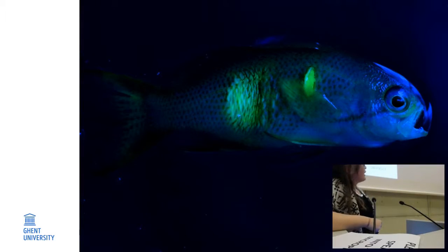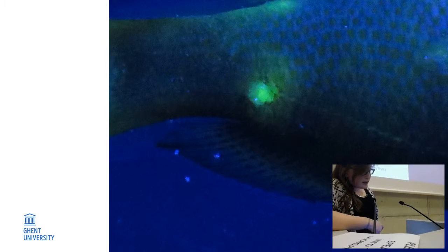If you do so, you can get this result. So here you see a fish with a more superficial lesion, and on the right side a deeper cut into the dermal and muscular tissue. Even smaller lesions, like the needle sting, can be made visible with this technique.